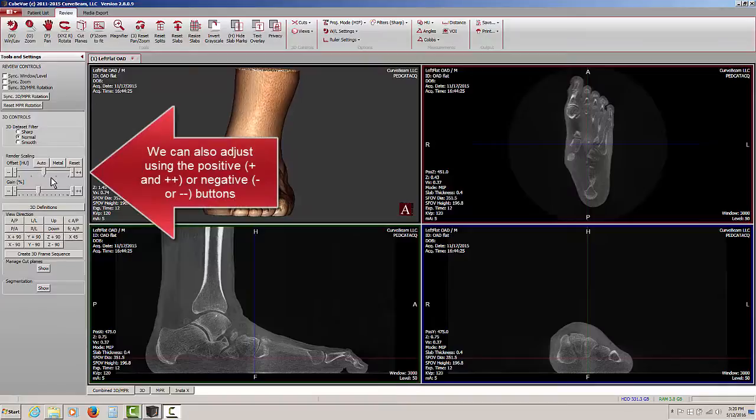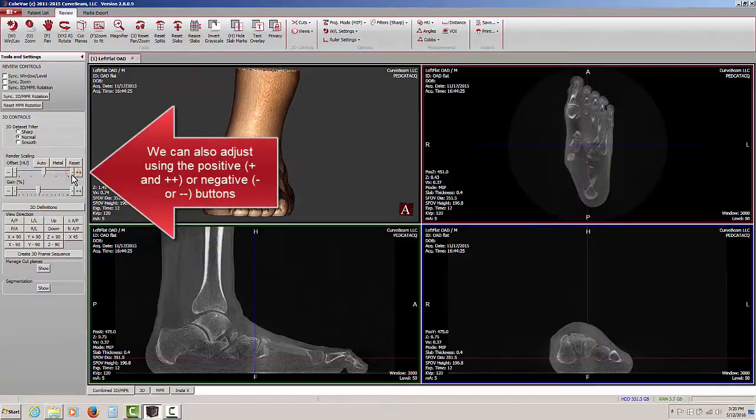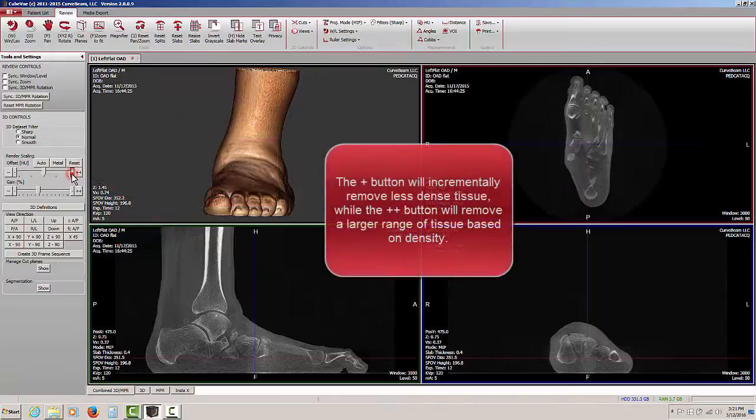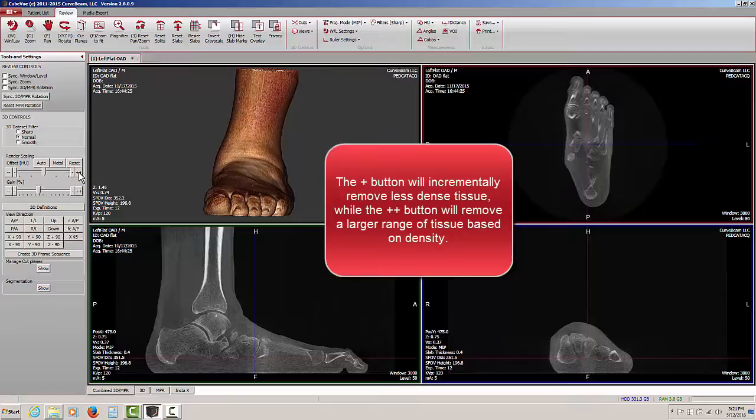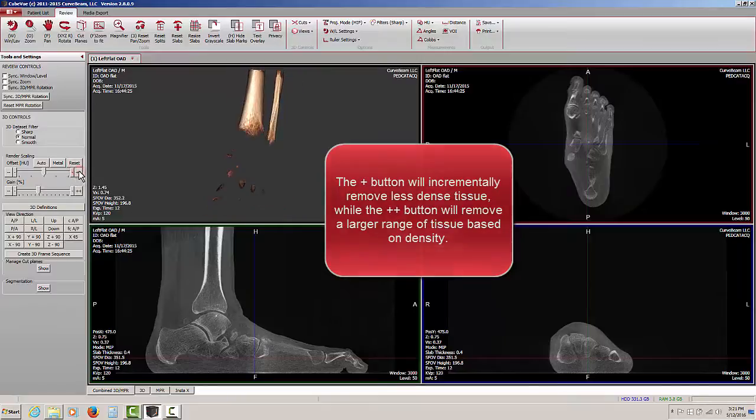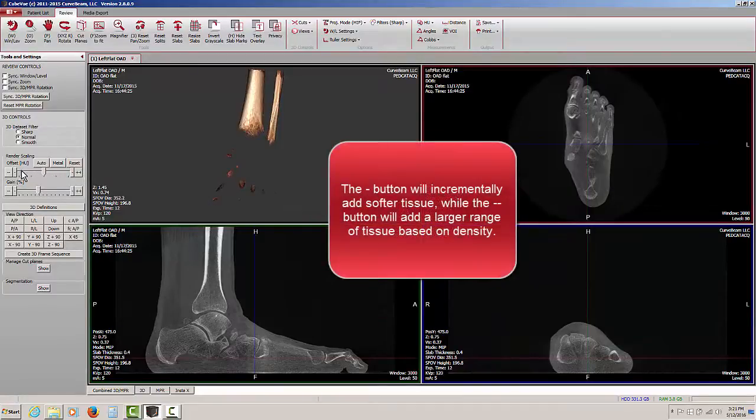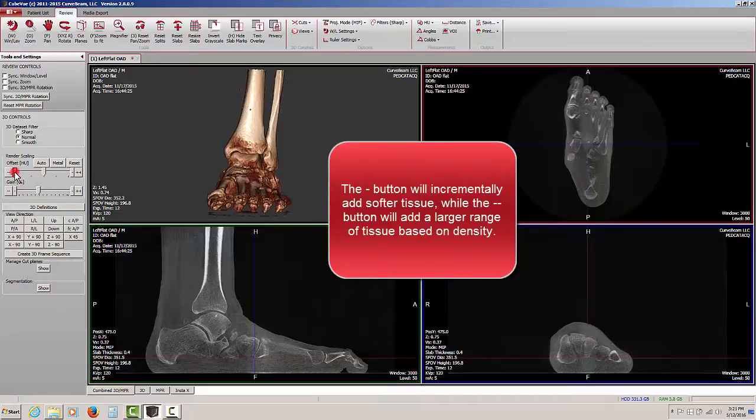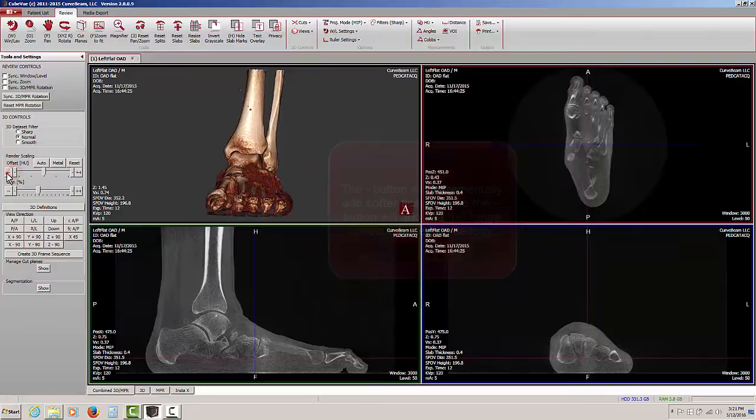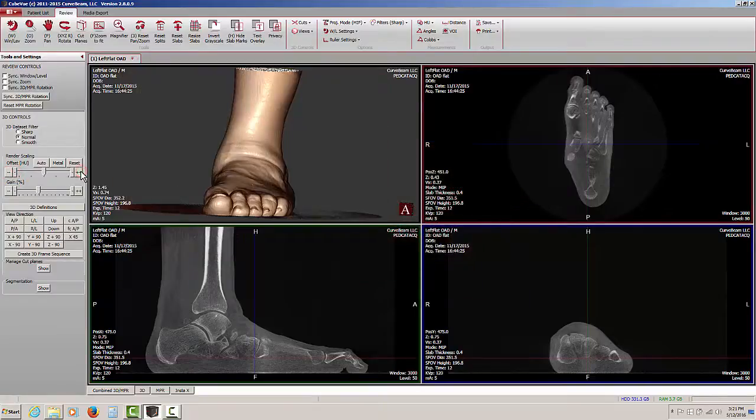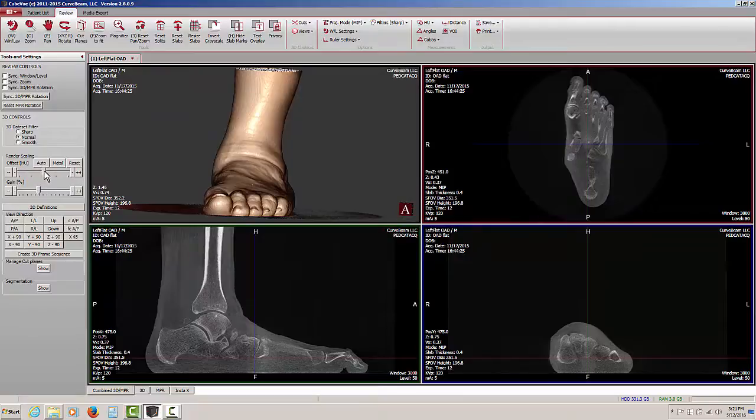We can also use the buttons on either end of the sliding control. We can click on the plus button, the smaller one of the two, and make minor adjustments, or we can make larger adjustments by clicking on the larger of the two buttons. When we go back to the other end, we can make major adjustments by clicking on the double minus, or by clicking on the smaller button we can make minor adjustments. This serves the same function as a sliding bar, giving you a slightly different feel or level of control.